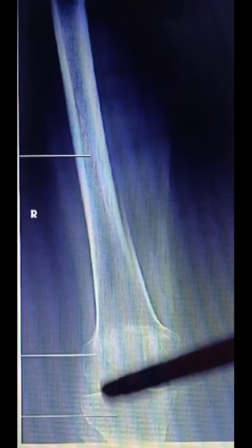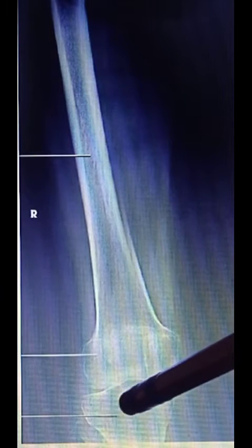So, for the anatomy demonstrated, we have here the femur. So, this is the femoral bone. And we have here the lateral epicondyle and the medial epicondyle. Then, we have here the knee joints along with the proximal end of the tibia and a little superimposition of the fibula here. So, the knee joints will not appear fully open because of the divergent of the X-ray beam.